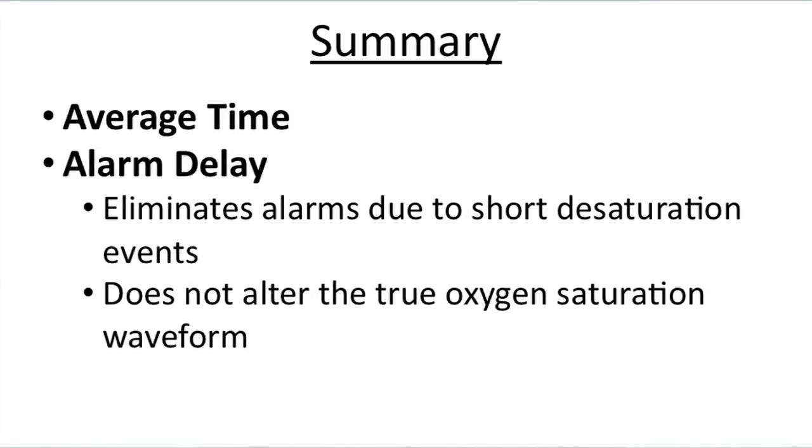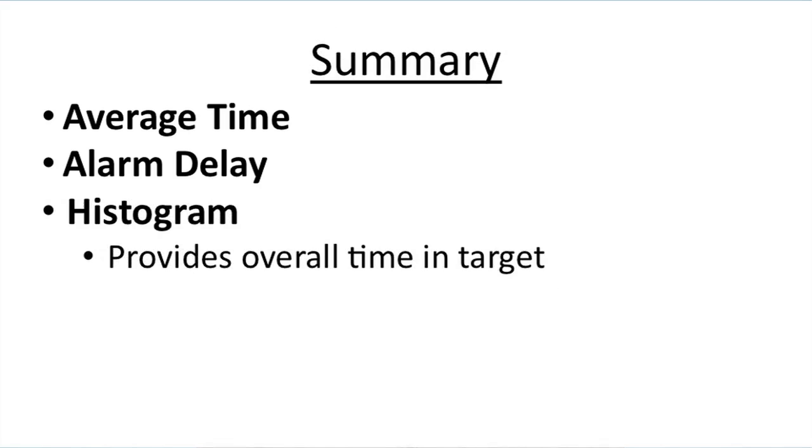The alarm delay can eliminate alarms due to short desaturation events, and it has the advantage that it does not alter the true oxygen saturation waveform. And lastly, the histogram can provide overall time in target to provide feedback to the nursing staff.